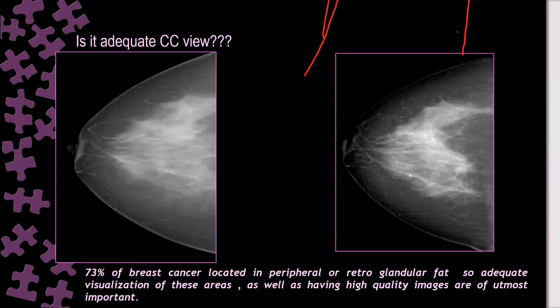If you are in doubt, why not give the patient the benefit of the doubt? Yes, that's right. If you have an optimum MLO and you are in doubt in the CC view, do it.